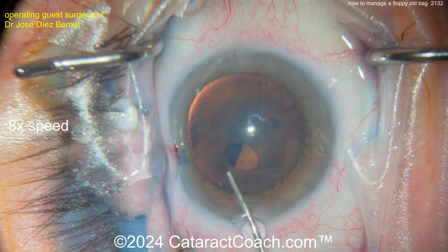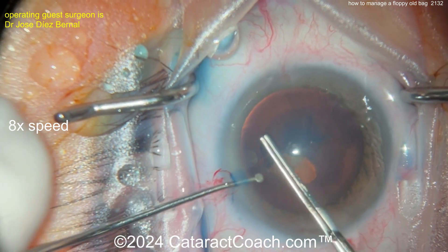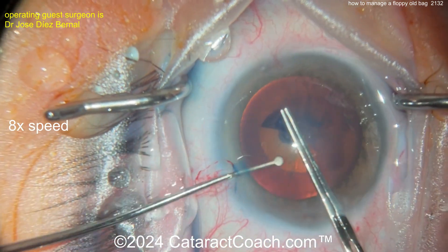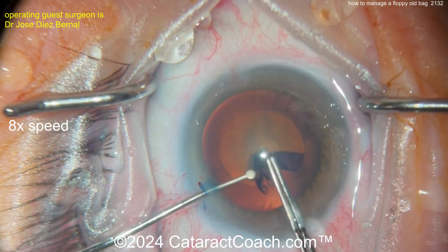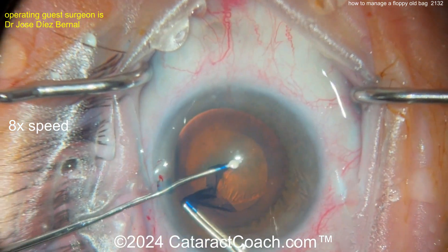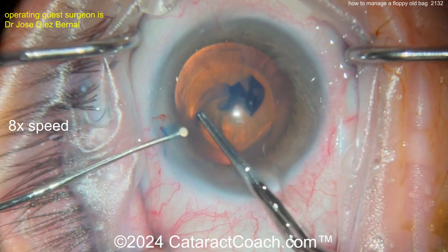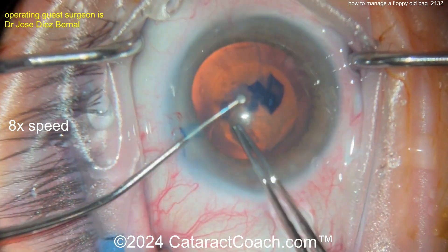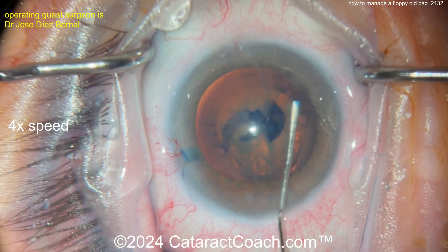Blue dye used to stain the capsule. Now the rhexis is being done. Watch carefully — it looks okay, but there's wrinkling. Look at the wrinkling of the capsule. This is your sign that you're going to be in a world of trouble if you're not careful. The whole nucleus is moving and the capsule is wrinkling as you're making the rhexis. That anterior capsule rim was really deforming during the rhexis.